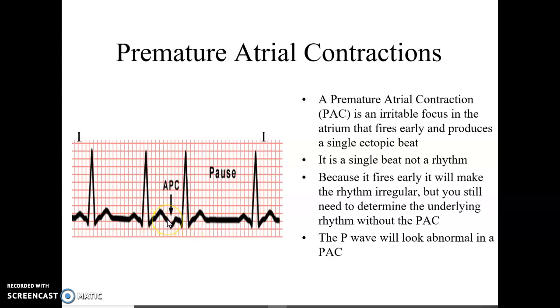A really big distinction to make is that my PR interval is still a normal measurement. In future classes when we start learning about things that come from the junction, we'll find that we can get upside down P waves with that as well, but the PR interval would shorten. This one here has an upside-down P wave but a normal PR interval. You'll also notice that this QRS complex does not change in its configuration. So this is going to make this a premature atrial contraction.